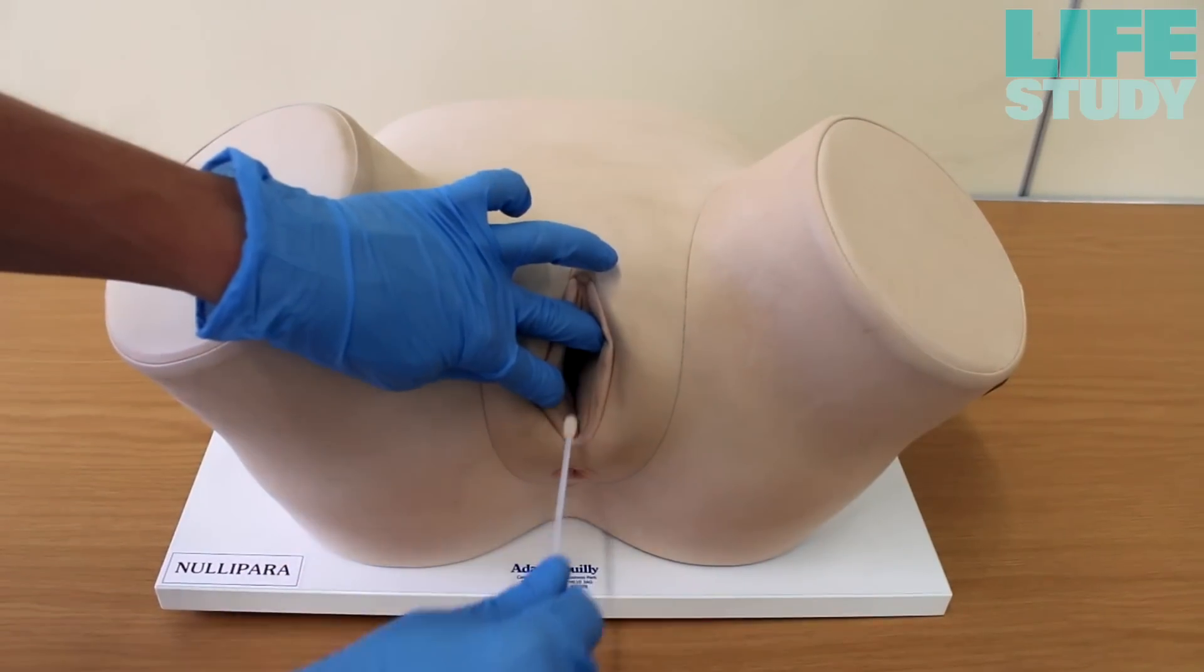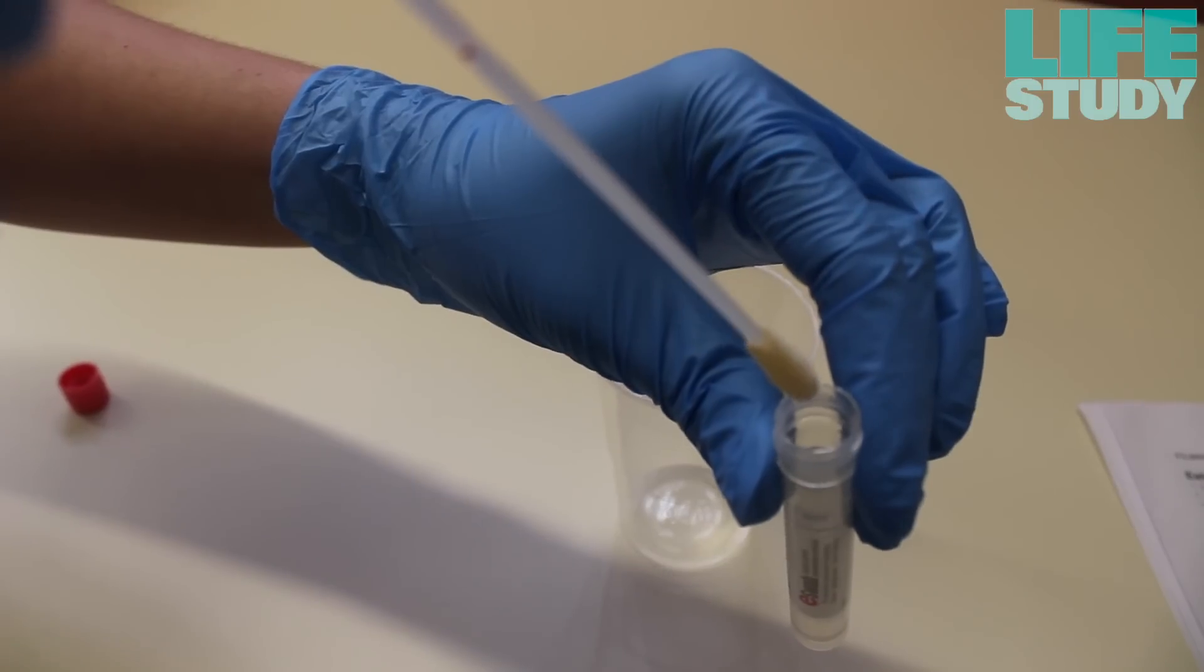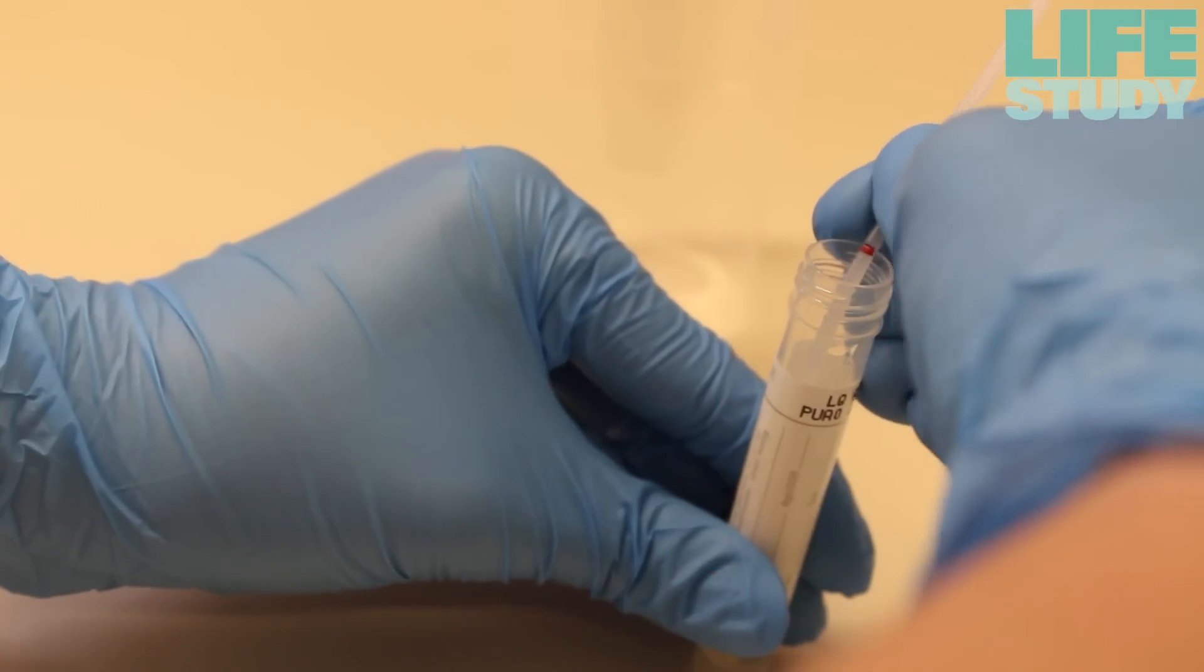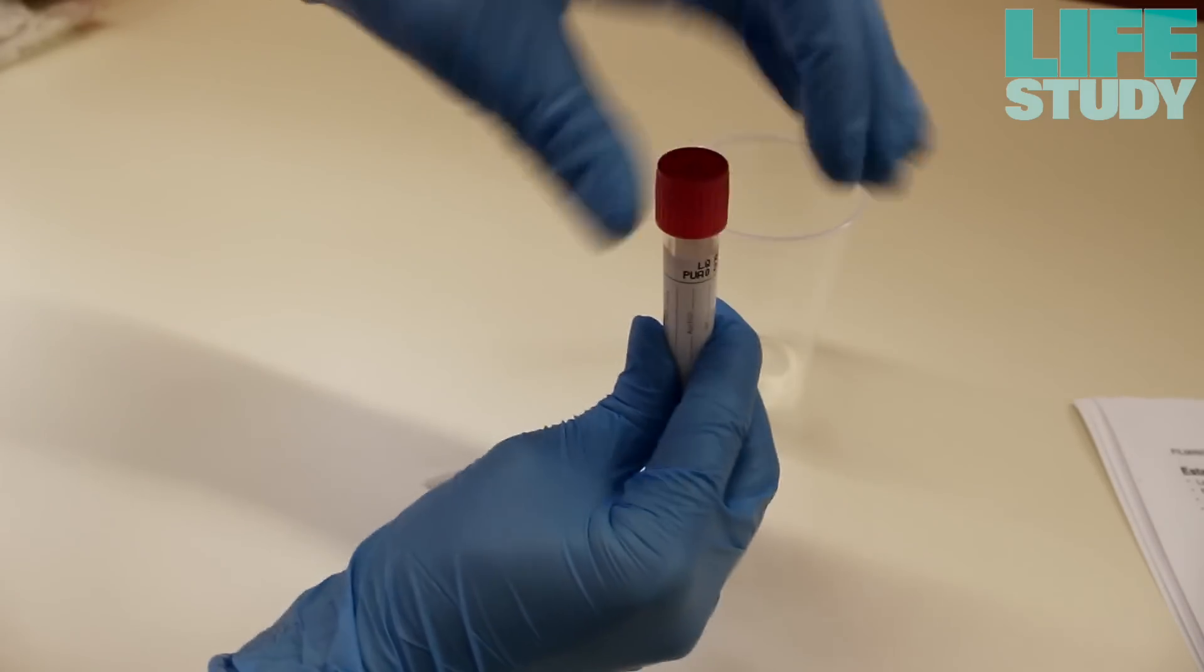Remove the swab from the vagina, again being careful not to touch the tip of the swab. Place the swab into the liquid in the collection tube. Gently break the swab at the red line by bending the handle until it snaps. Replace the cap firmly and gently swirl the collection tube several times.